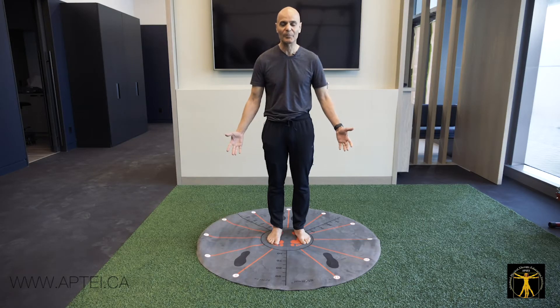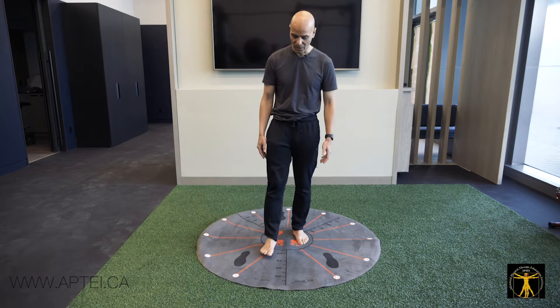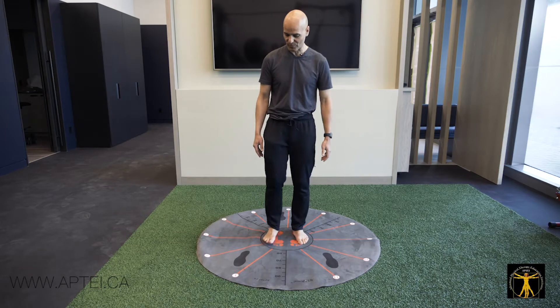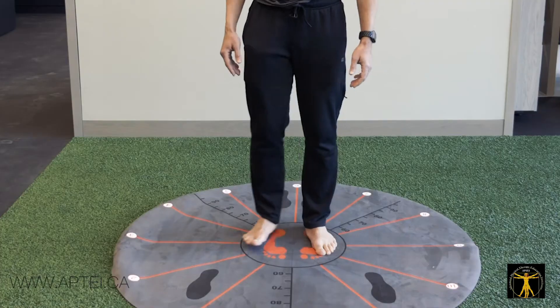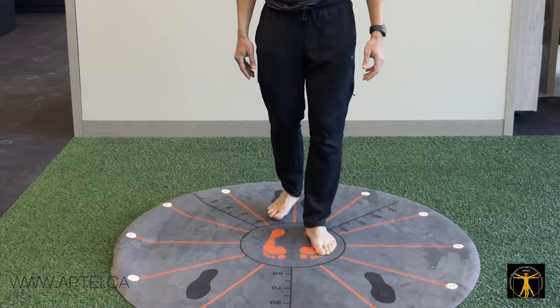The simplest exercise I begin with is called clock steps. You stand there, step to 1 o'clock and come back to the center. Step to 2 o'clock, come back to center. Step to 3 o'clock, come back to center. 4 o'clock, 5 o'clock, and 6 o'clock.